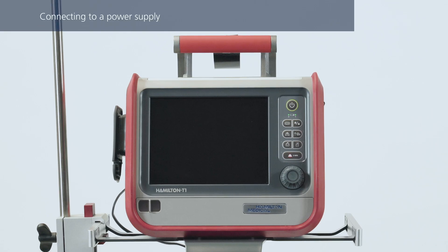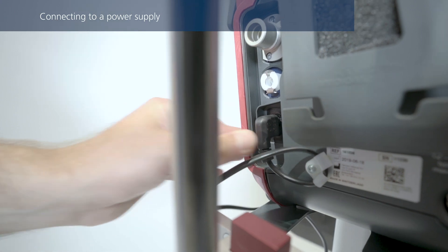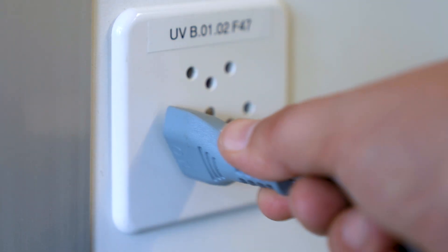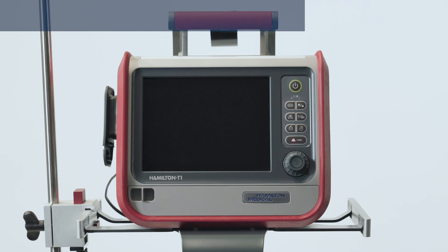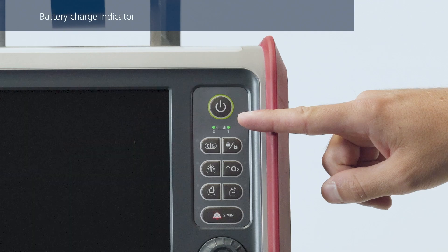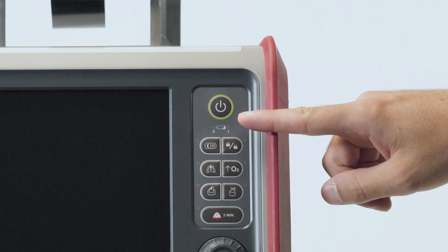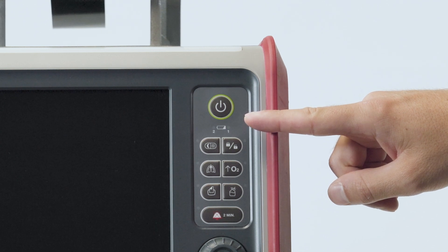Check the power cable is securely in place to make sure it can't disconnect accidentally, and then connect it to the primary power outlet. The battery charge indicator is solid green when the battery is fully charged and connected to primary power, even when the ventilator is turned off. If the indicator is flashing, this tells you the battery is still charging.